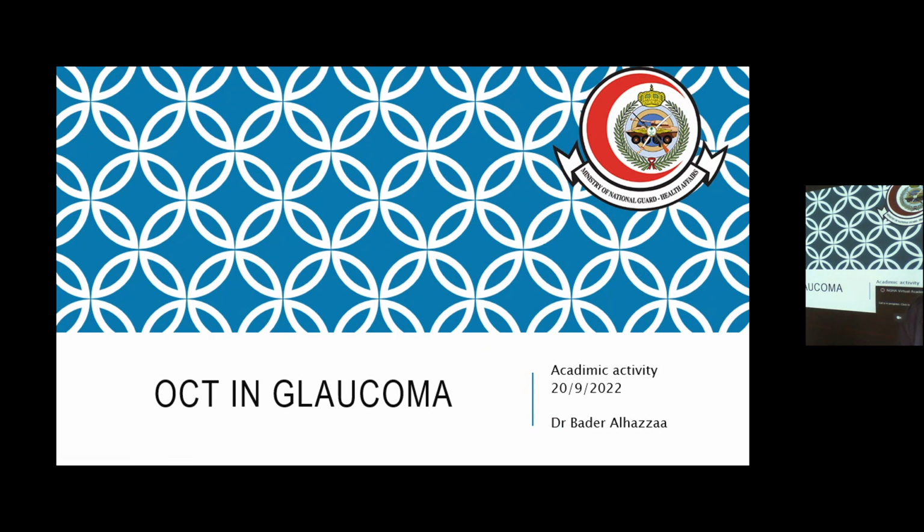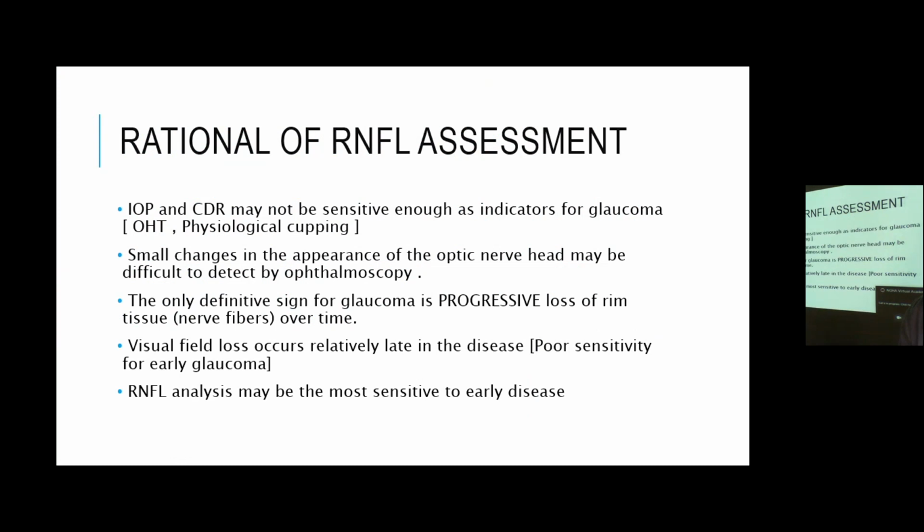Short topic. إن شاء الله it will be easy. First, our rationale for retinal nerve fiber layer thickness assessment.